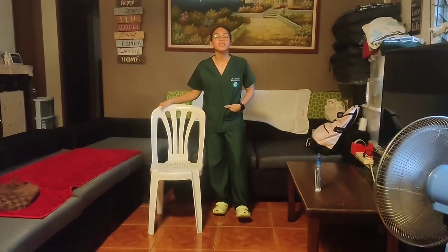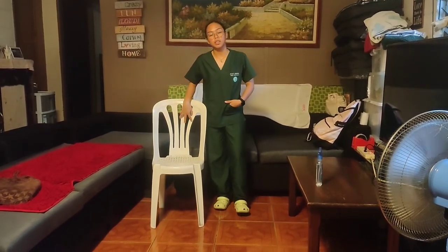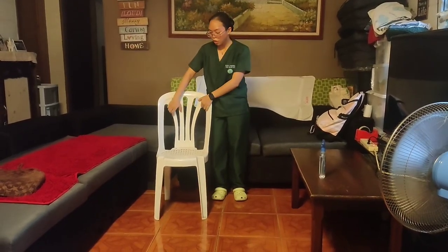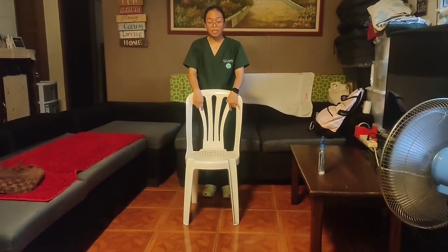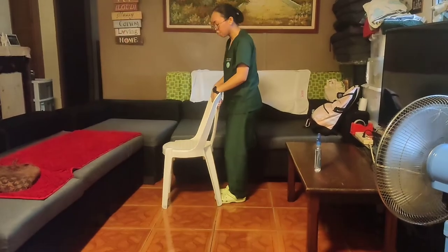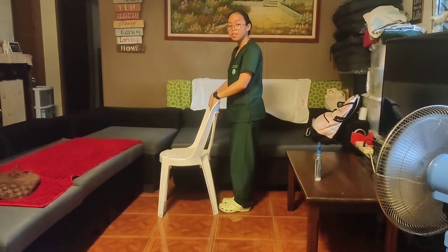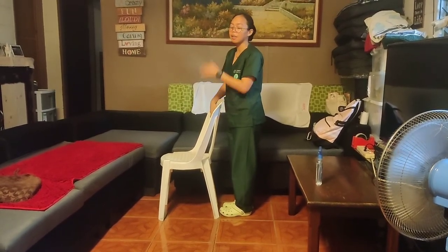Lastly, we need to ambulate our patient using a walker. Instruct the patient to stand at the center of the walker. Place the patient's hands on the hand grips, and make sure the elbow is bent 15 to 30 degrees.